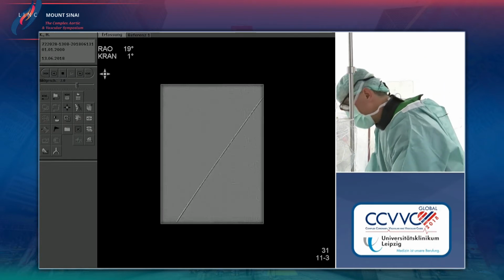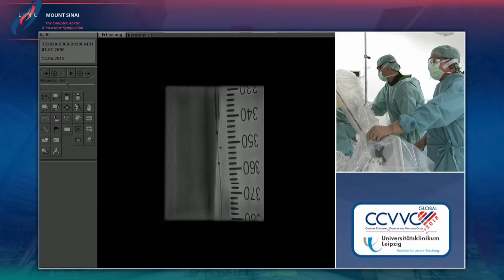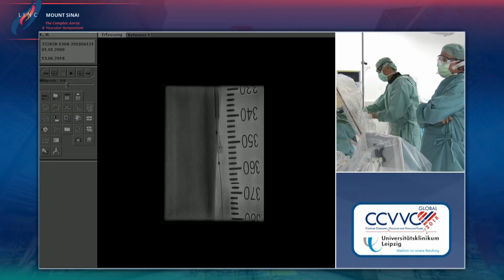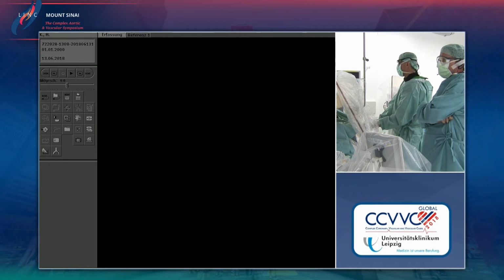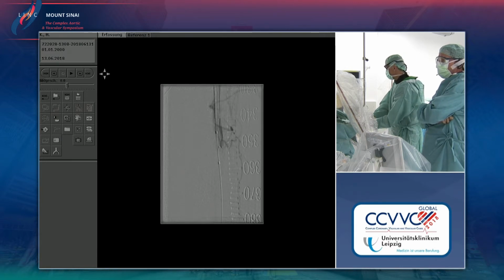This went into the artery again? Do you think IVUS? Yeah, if we have time to show you, IVUS would be nice. In this case, that's actually a good point. It may be more difficult with all this contrast around the artery to see dissections, and therefore maybe IVUS would be a good idea. Can we turn his mic on?